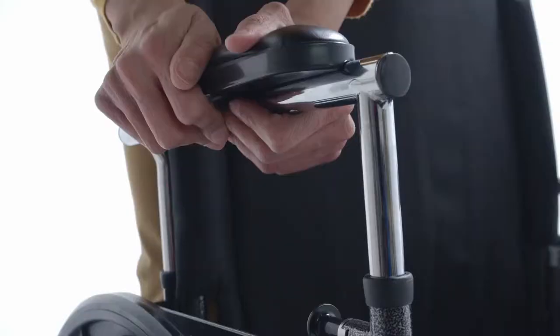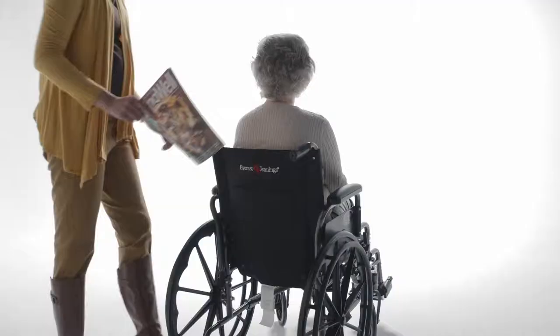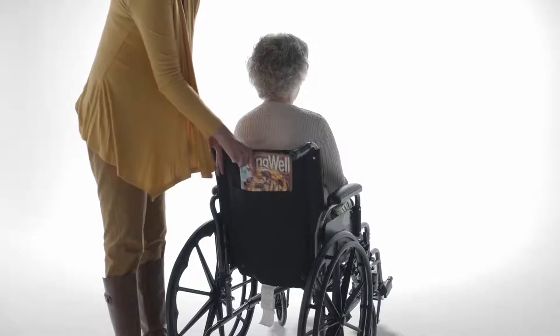This chair is available in different arms, including flip-back desk, full-length, and height-adjustable flip-back arms. All come with padded armrests for patient comfort.